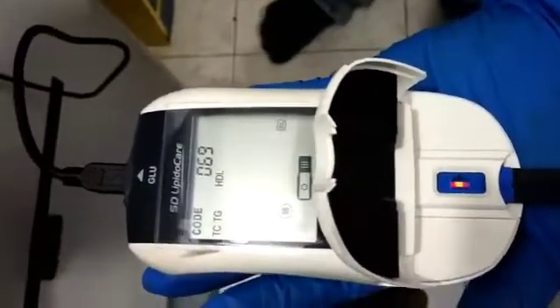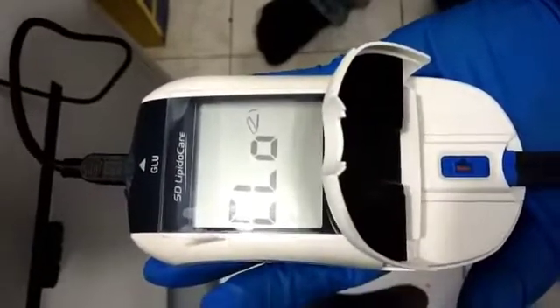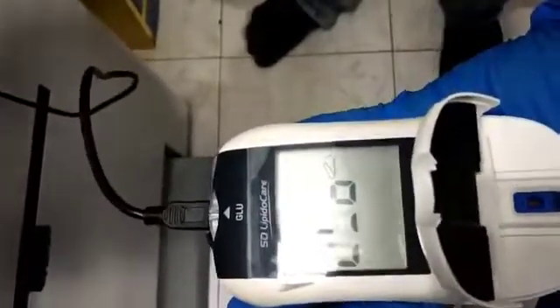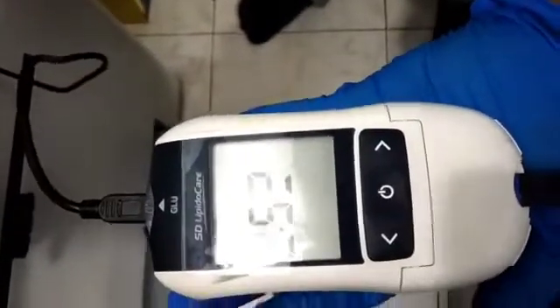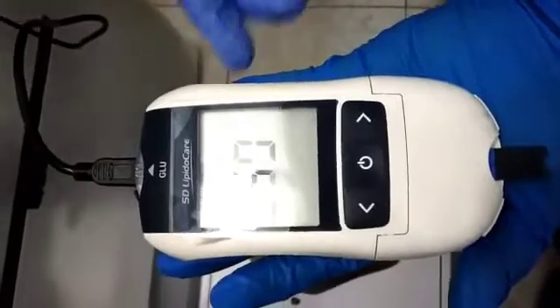We have applied the sample. Now it is asking us to close the panel. Now wait for 3 minutes, then it gives the result.